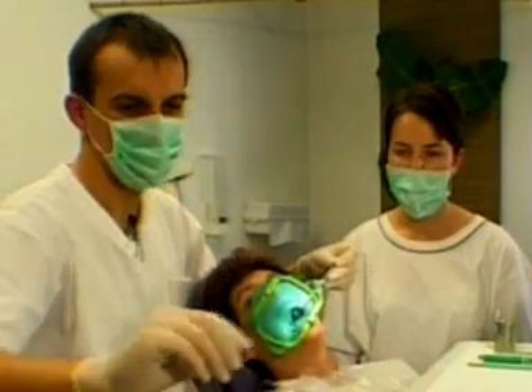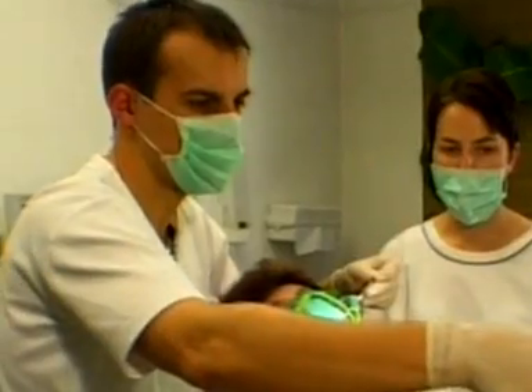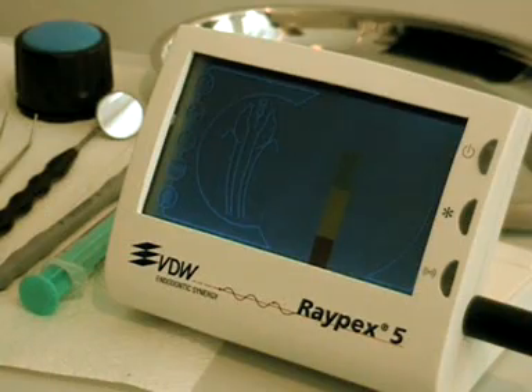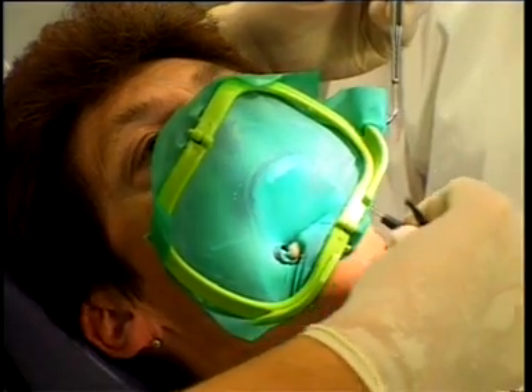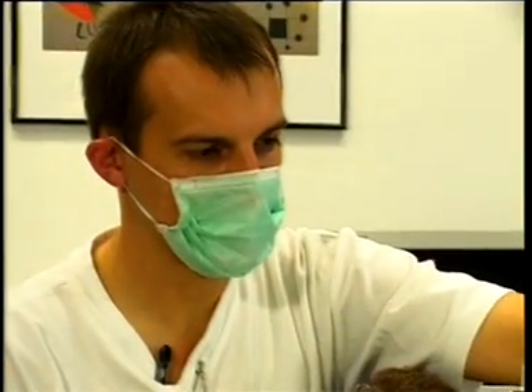Now we determine the electronic length as follows. Turn on the RAPEX device. Place a lip clip on the patient's lip on the opposite side of the tooth to be treated. This is important to avoid the risk of a short circuit.